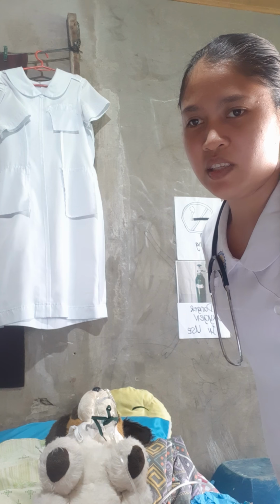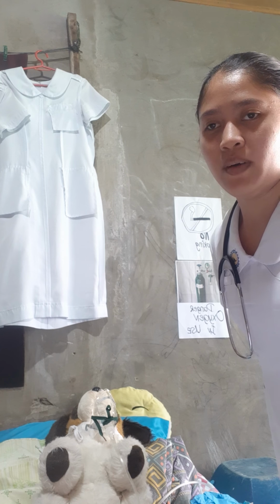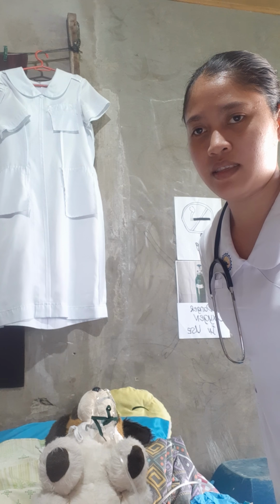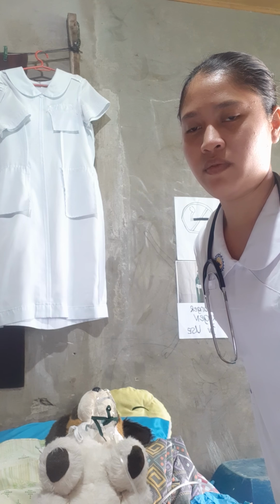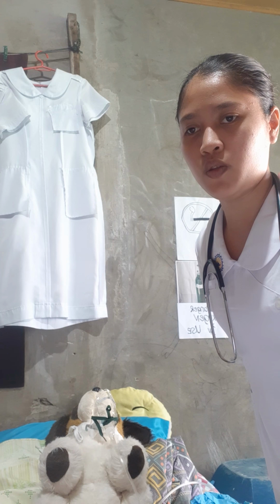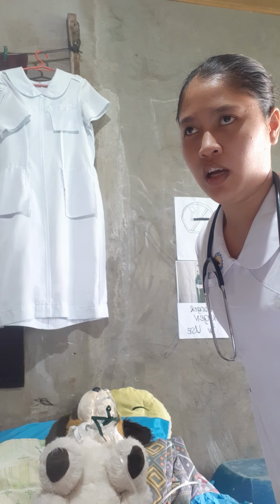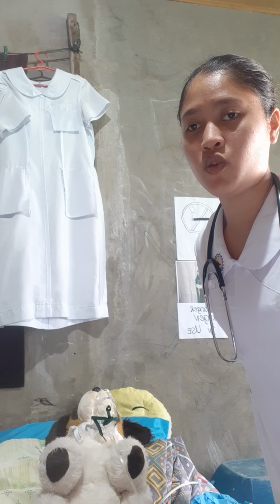Good day, ma'am. I am Chris Madel Tayo, your nursing aide for today, and today I am going to demonstrate providing tracheostomy care. The purpose of this procedure is to maintain the airway's patency, maintain cleanliness, and prevent infection of the tracheostomy site, and also to facilitate healing and prevent skin excoriation around the tracheostomy site, and also to promote comfort.